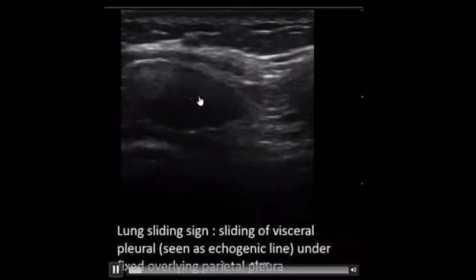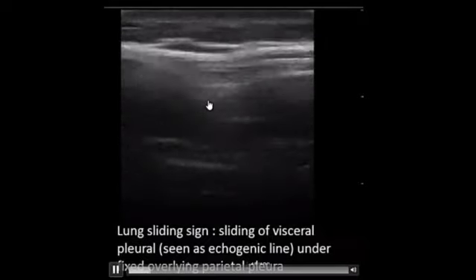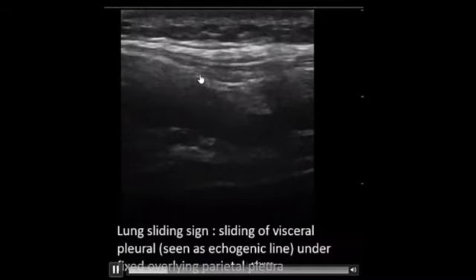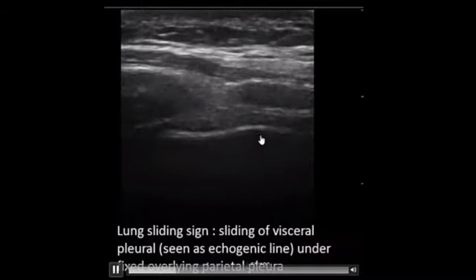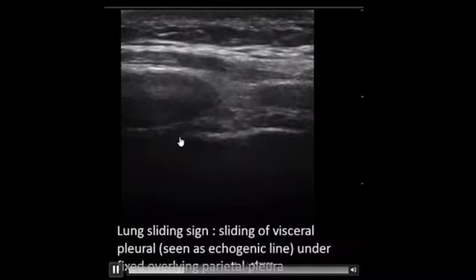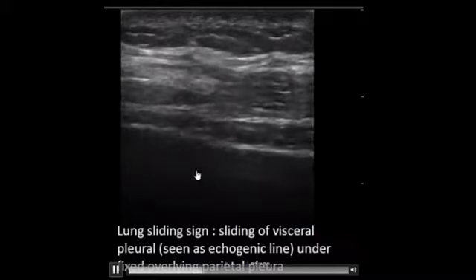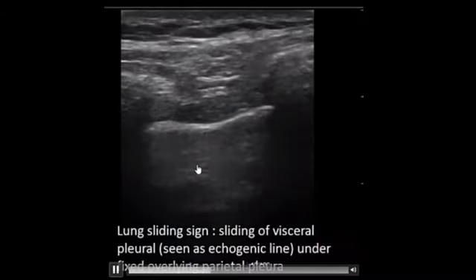Now, the lung sliding sign. Sliding of the visceral pleura is seen as an echogenic line under the overlying parietal pleura. We see sliding of the visceral pleura under the parietal pleura.